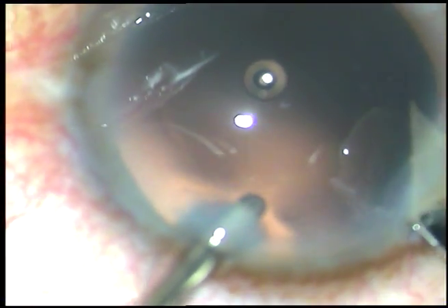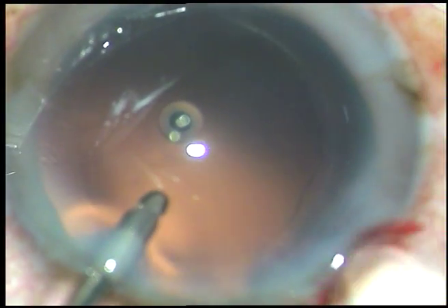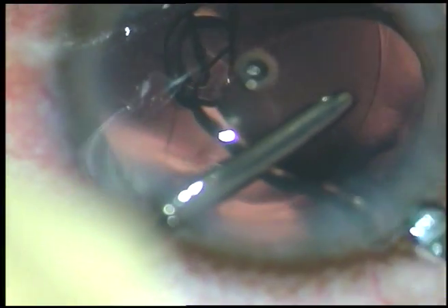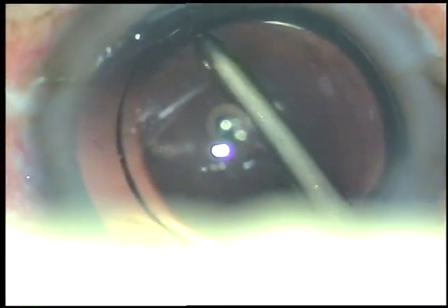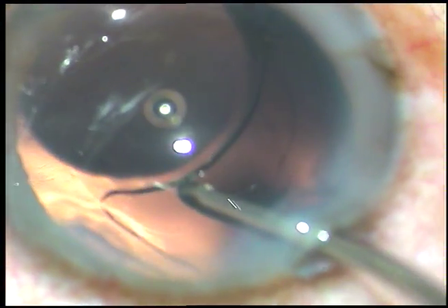Now I am enlarging the main incision a little bit because the cartridge is an A-cartridge. And now the intraocular lens is going straight into the capsular bag. The irrigating probe supports the optic and places the haptics in the capsular bag.